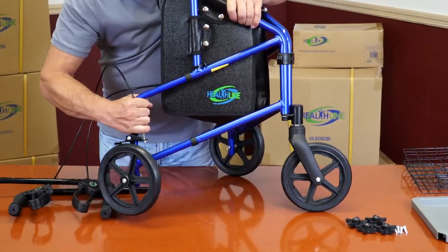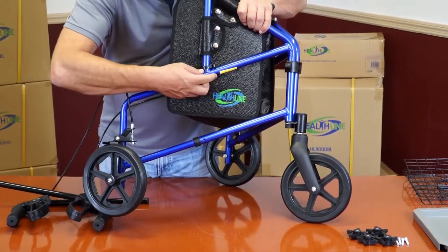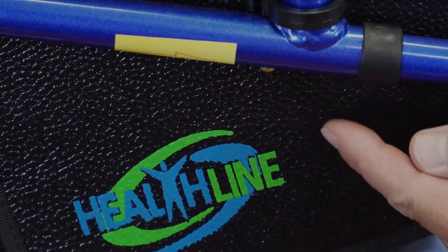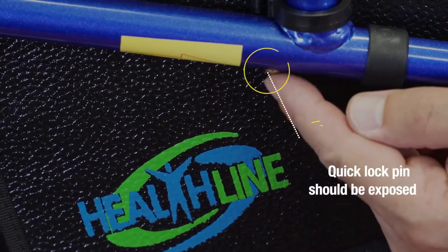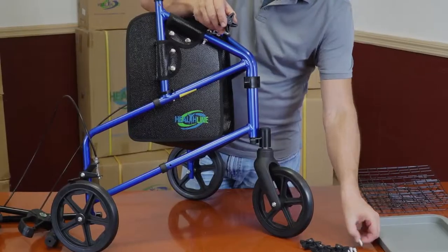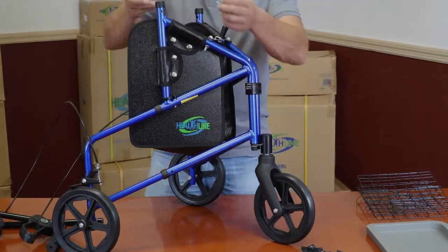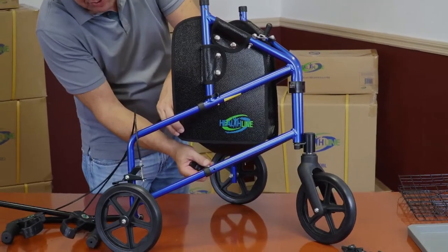Assemble the wheels. Firmly grab one of the rear wheel frames and pull it out until you hear it click into place. If done right, you should see the quick lock pin pop out from the hole in the upper tube. Grab one of the steel bolts and insert it into the hole in the lower tube from the inside of the frame.